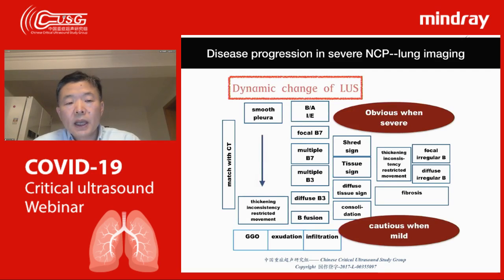So now we also need to integrate all this information. You see, we combine CT scan and also our lung ultrasound together. From the point of care, it is even very difficult to get this kind of information. Now you stand close to your patients, to get more frequent information, and from static information to a little bit dynamic. And also these two images you can put together, and they can tell us the same information. So I think this goes from A line to the consolidation or a pleural effusion.